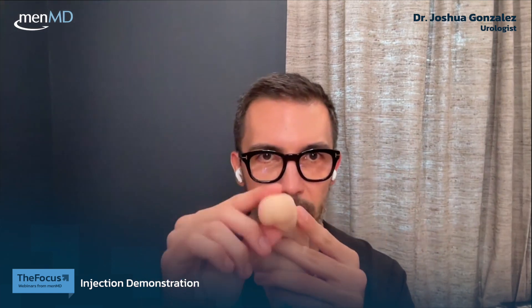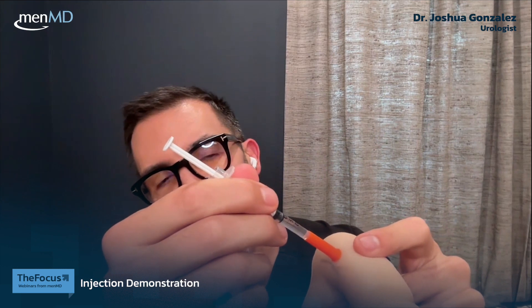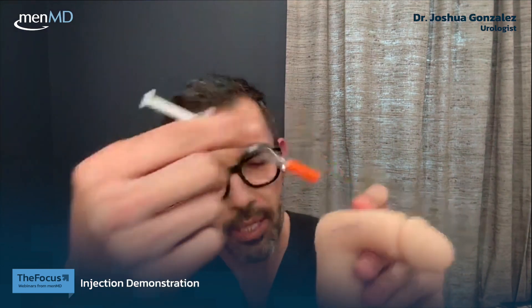Now here's your anatomy. We look at the penis sort of as the face of a clock, and we want to inject at 1 to 3 o'clock or 9 to 11 o'clock. I've made a fake vein here, so if I were telling my patient where to inject, I would tell them to go right above the visible vein so that you're not injecting into it. Hopefully you can see that.